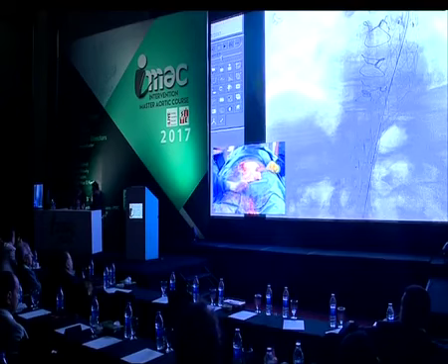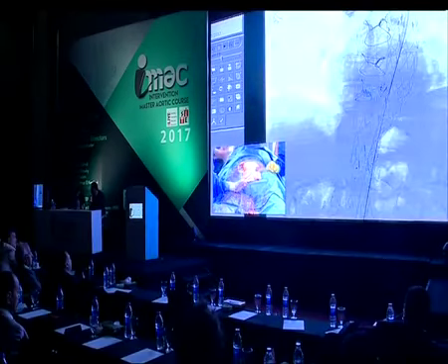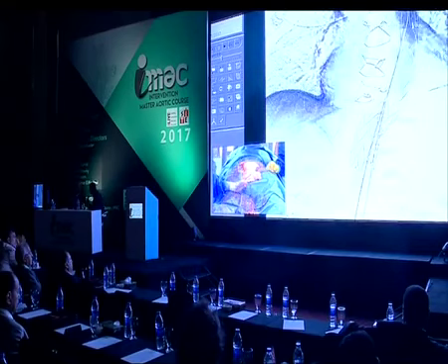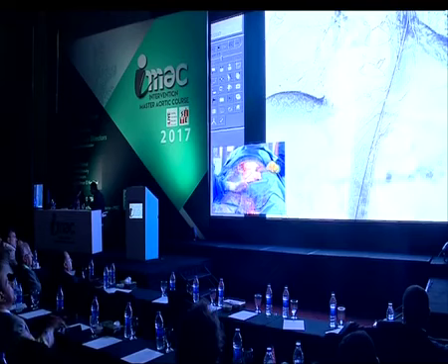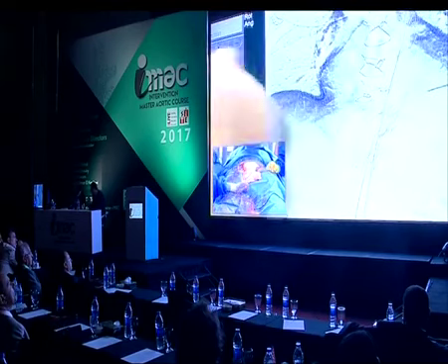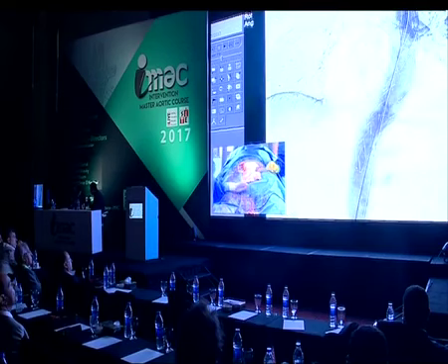What was the pressure before deployment? In fact, the run is fine.